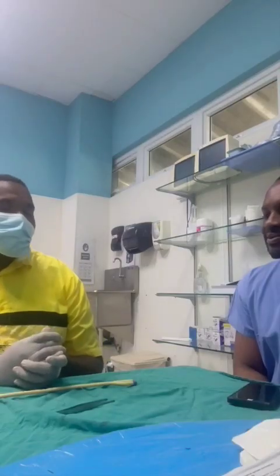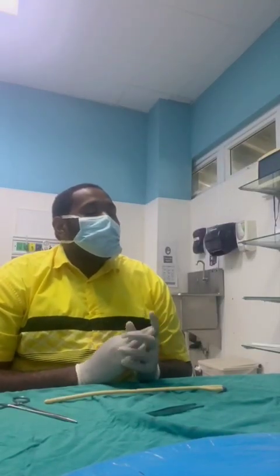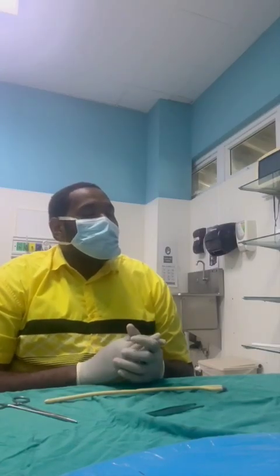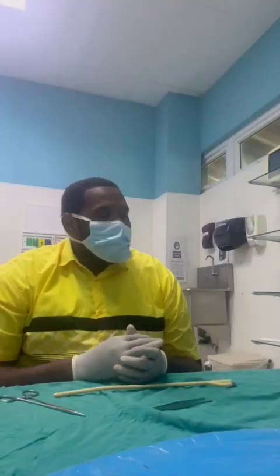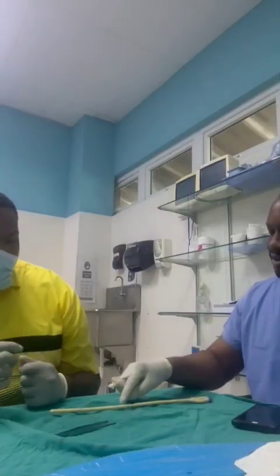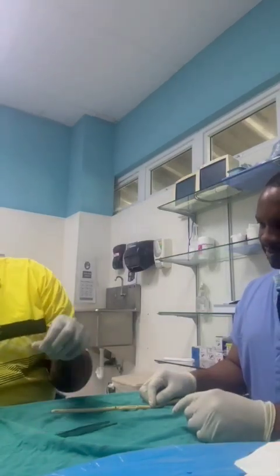Oh, yes, sure. So we have natural sutures, which are things like silk, and synthetic such as Prolene. We have monofilament sutures such as Monocryl. We have polyfilament sutures such as Vicryl. We have non-absorbable sutures such as Prolene, and we have absorbable sutures such as Vicryl. Excellent. Now, I would like for you to suture this wound at a rate of 3 stitches per minute, using the tissue forceps and needle holder.